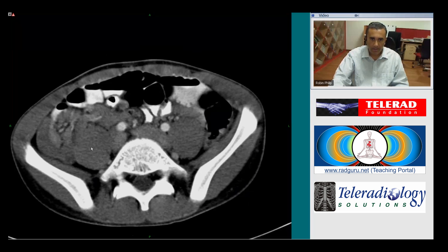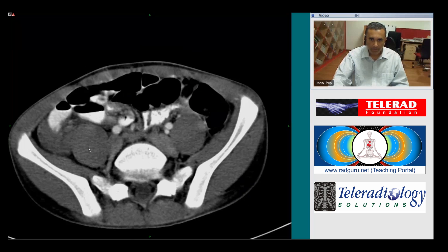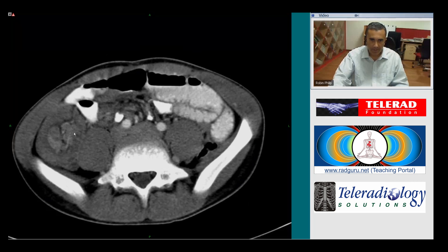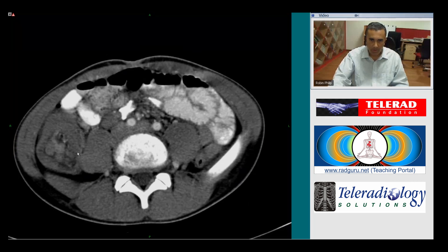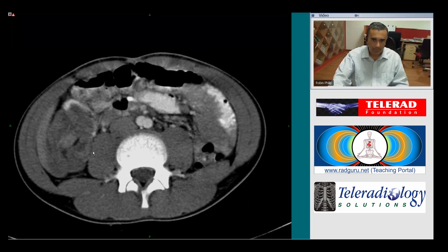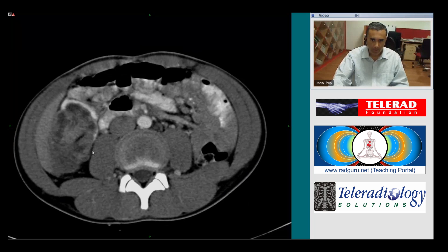The pathognomonic feature of this entity is the presence of mesenteric fat and vessels within the lumen of the outer bowel — in this case, the colon.